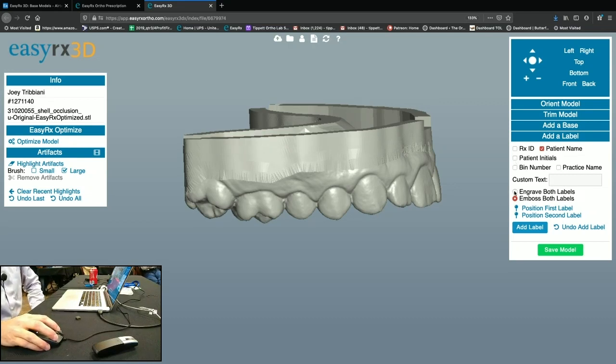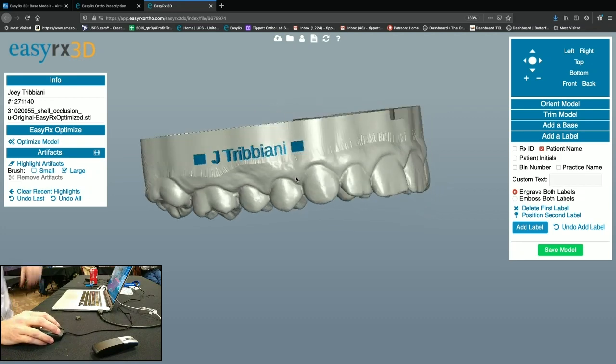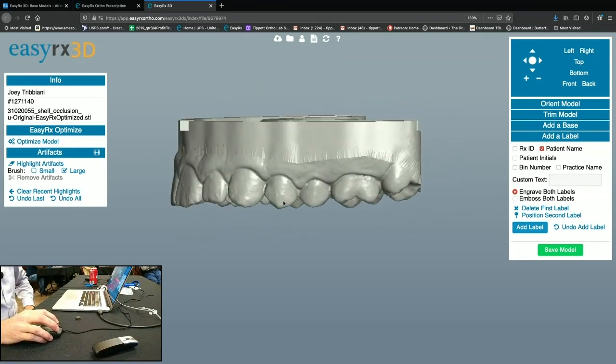So I'm going to engrave it, and then I'm going to say position first label. And it's like reading from left to right. You put your left block and your right block, and it'll fill in between them the name, and then you can adjust it. You can't adjust the size or font or anything just yet. Let's put the other one in.